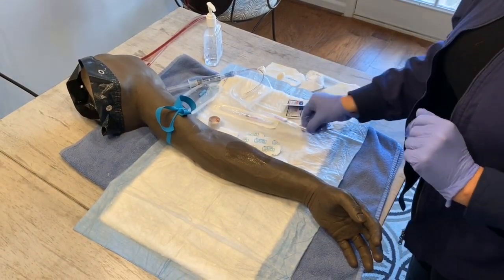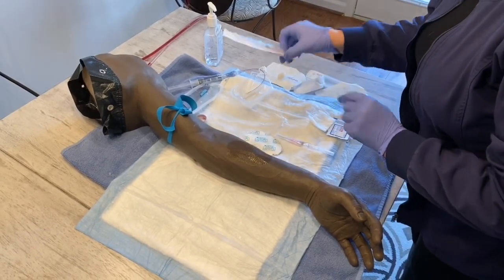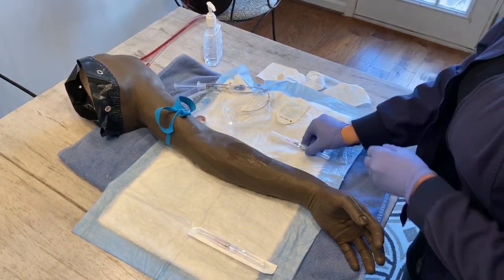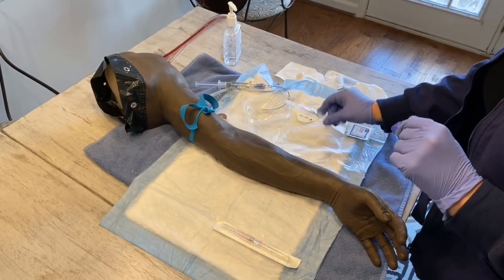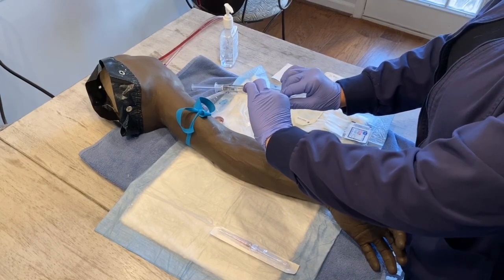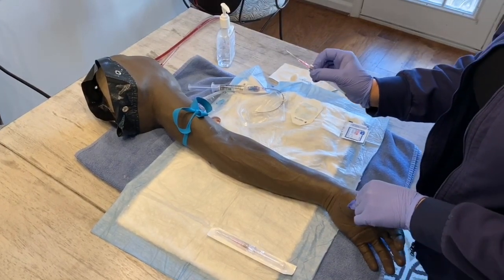While we're in the process of letting it dry, I'm going to go ahead and rearrange my field, getting it ready for the insertion. And I want to get everything close that'll be very easy for me to access. Now that my site is dry, I'm going to go ahead and pick up my catheter with my dominant hand. I'm right-handed. I'm going to take my non-dominant hand, pull the cap off of the catheter, straight off, and I'm ready to insert the catheter into the vein.